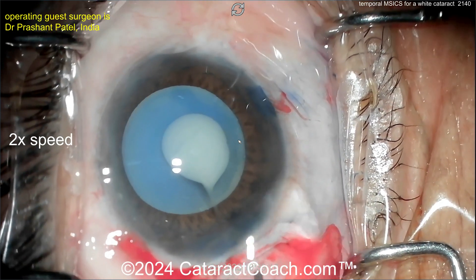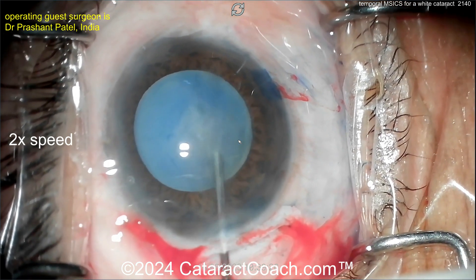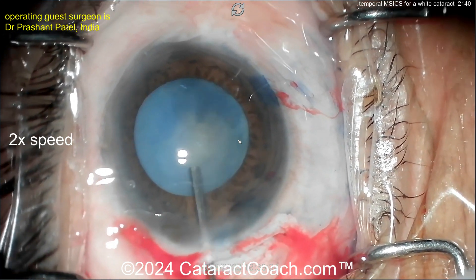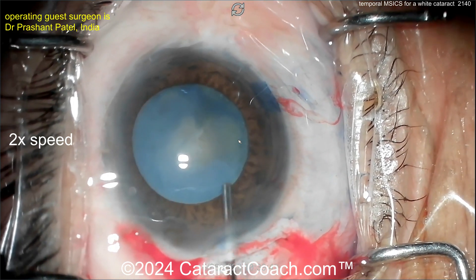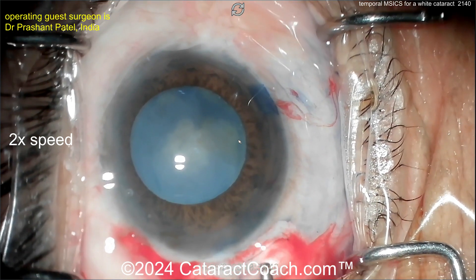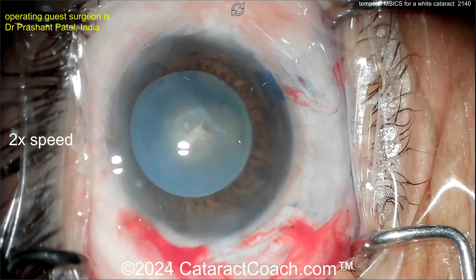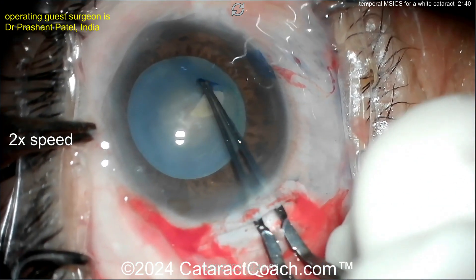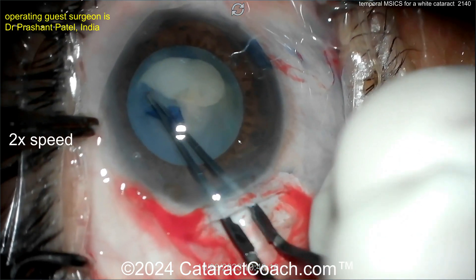Let's decompress that bag — inject more viscoelastic, and here with BSS wash out all that intumescent fluid. Let it keep coming out, decompress the bag to prevent that Argentine flag sign. Very nice. Now more viscoelastic going inside the eye, and there is a little tear of the anterior lens capsule which you can use to create your capsulorhexis.